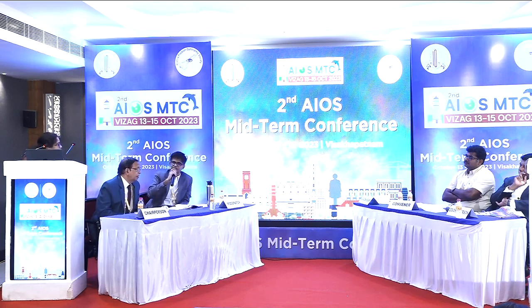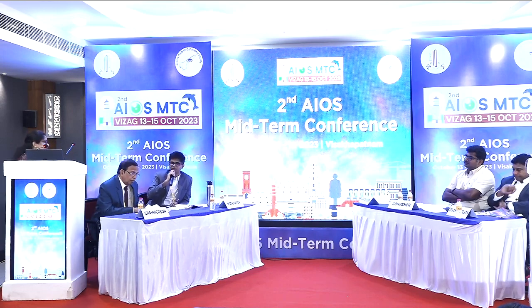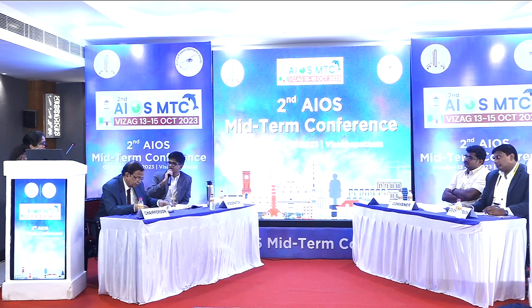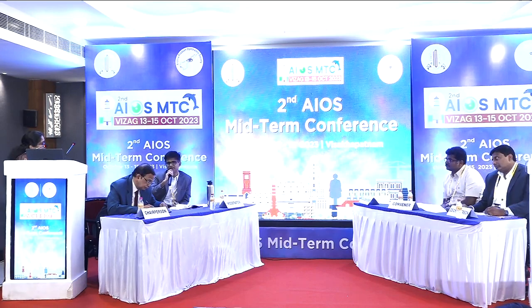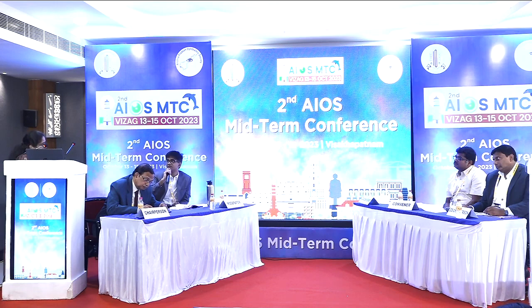See, we cannot conclude that OCT can replace. Okay, sir. We have not done any comparative study to tell anything, and the role is supplementary. So let us not go back with that conclusion. The number two thing is that while the RNFL thickness might remain high, the person will first start losing ganglion cells, so your macular GCL levels will start to deteriorate.